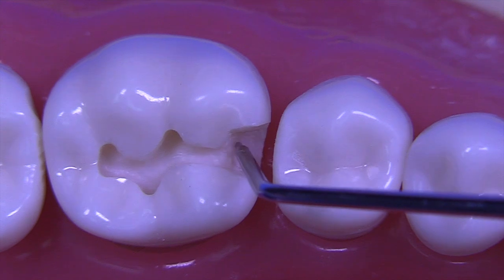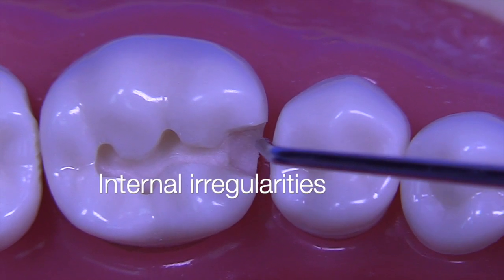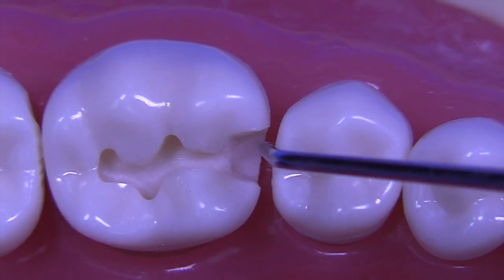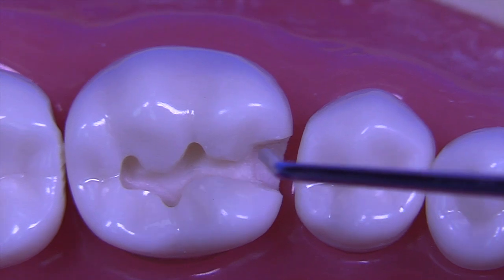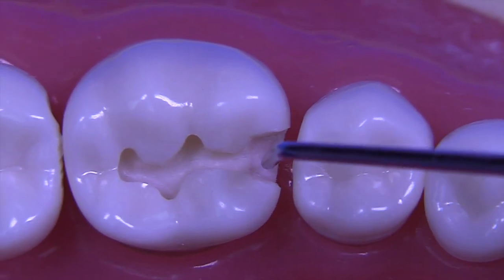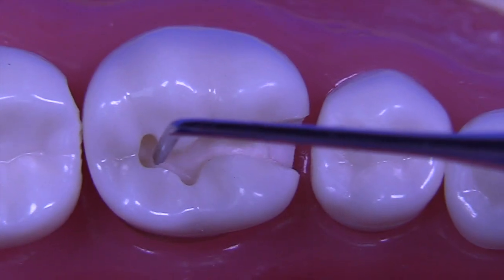We didn't quite get the line angles as clean and sharp as we'd like. We also left a little bit of irregularity here on the facial. Sorry, not the facial, but the gingival, which could have been smoothed off. And those areas could have been improved. The pulpal depth is pretty uniform.